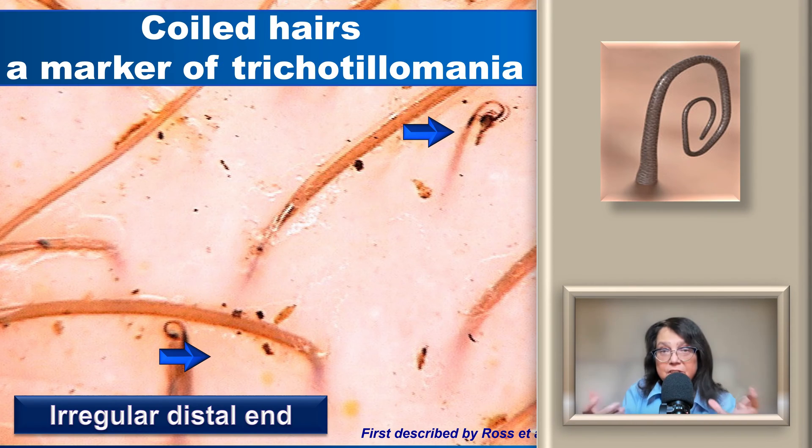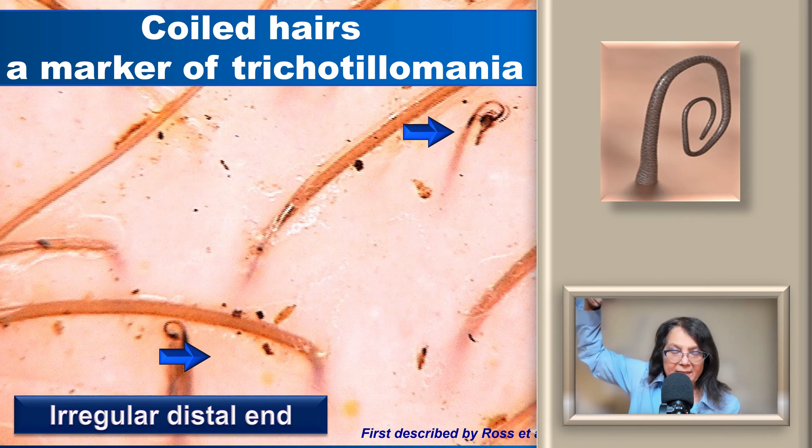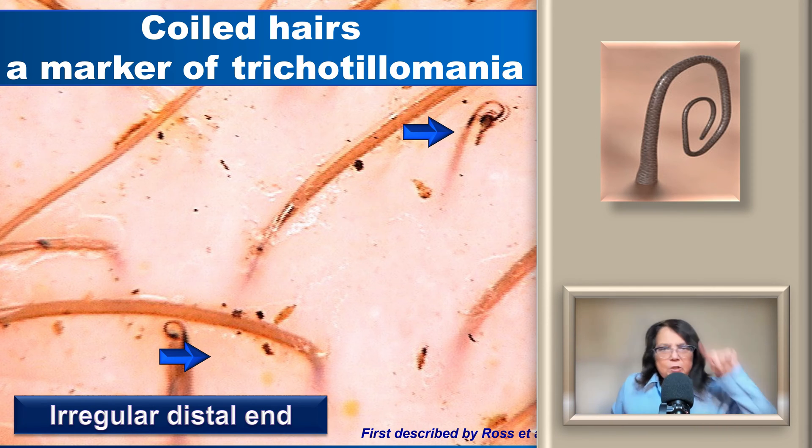A trichoscopy feature associated with trichotillomania are coiled hairs. They develop when the patient pulls the hair — when the hair is firmly attached to the scalp and then breaks or fractures, the distal end will coil, sometimes multiple times, and will usually be very irregular at the distal end. A single coiled hair in one field of view does not make the diagnosis, but if we see multiple features associated with trichotillomania, including multiple coiled hairs, this may be indicative of trichotillomania.